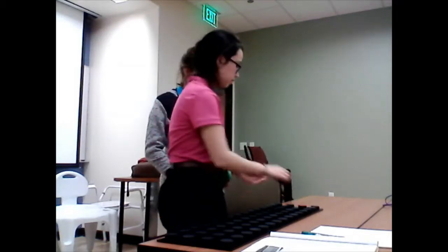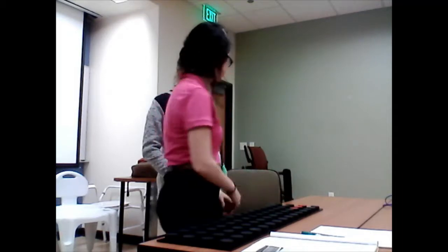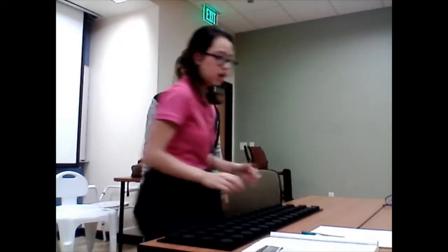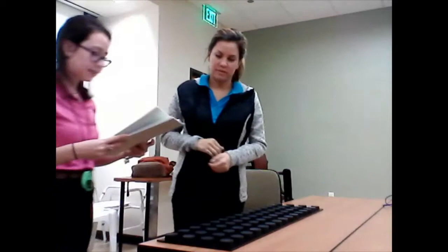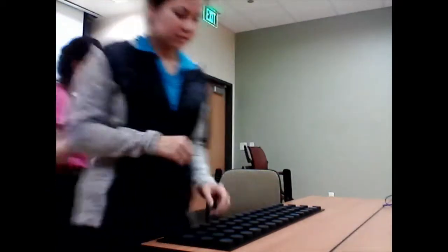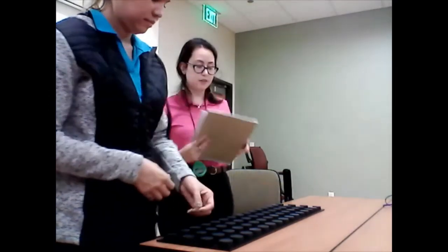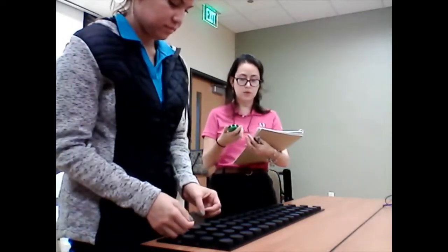Okay. Is it clear for you? Yep. Very clear. Your score will be the total number of seconds it takes to complete this task. Okay. Please place your hand right here. And on the count of 3, you're going to go. 1, 2, 3.